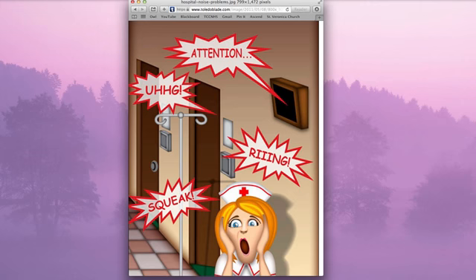So if your patient is ringing off again and again and again, you need to get your team together, respiratory therapy and the physicians, and see what can be done to improve the situation. The key is to not become immune to that sound, because one of those times, like the boy crying wolf, your patient really will be having a life and death event.